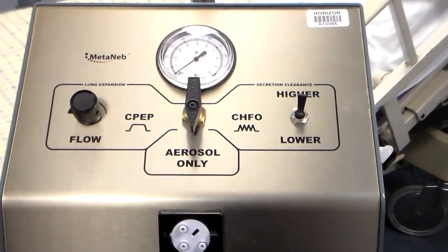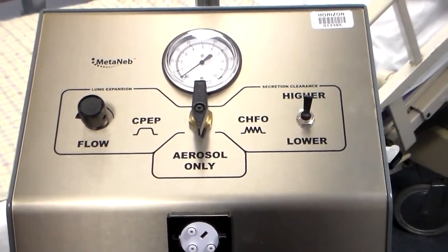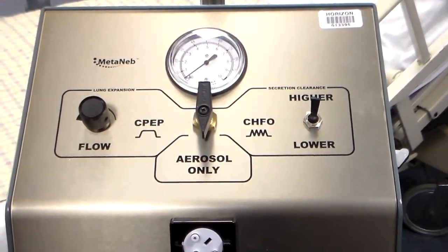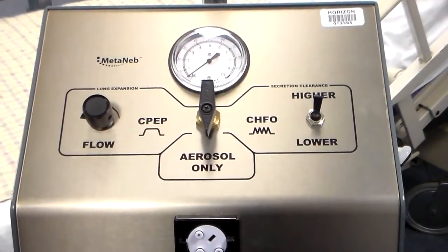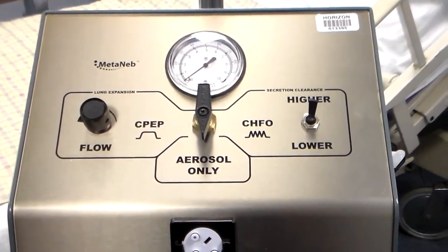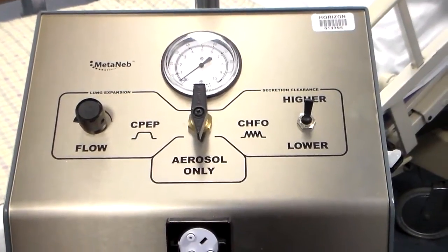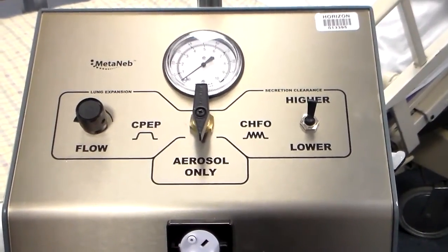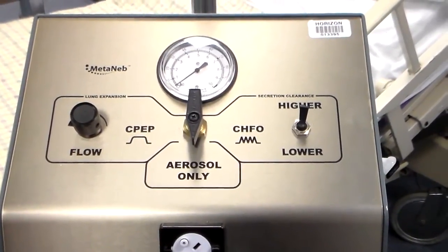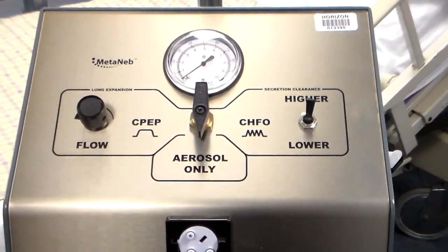CHFO, or continuous high-frequency oscillation mode, uses continuous pulses of positive pressure to oscillate the airways. This helps to move secretions to the upper airways and assists the patient with coughing and deep breathing. The third option, aerosol, is used to begin the treatment and when the patient requests a break from the CPEP or CHFO.